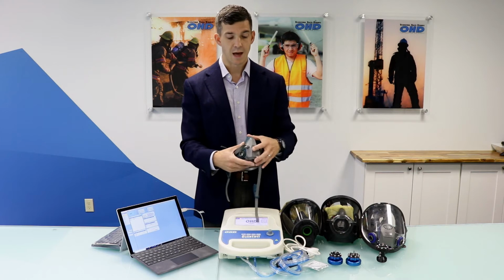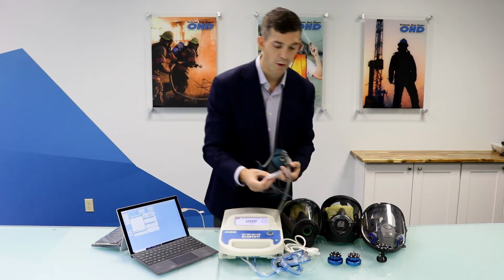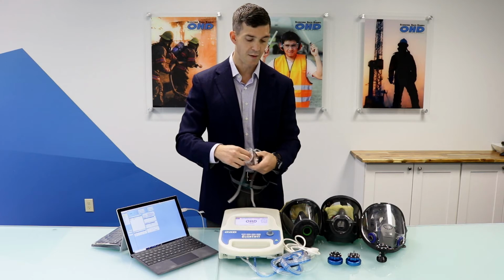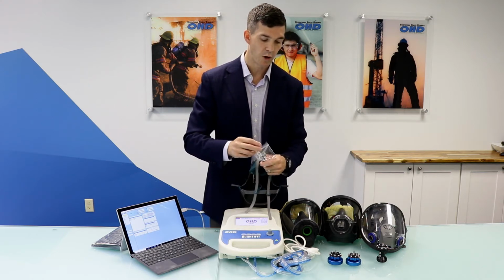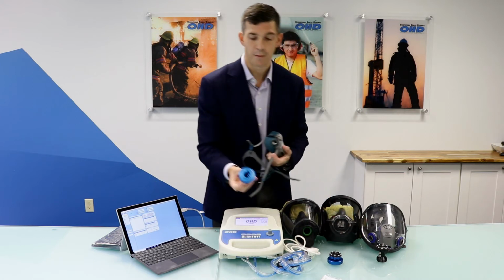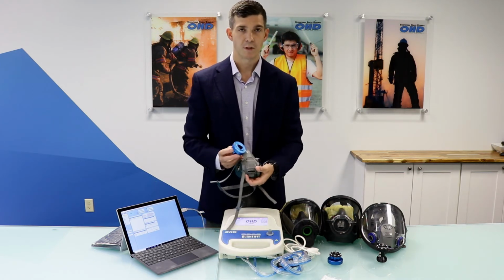So a couple of things. This obviously is a half mask elastomeric. The main thing you need to know about these respirators to test is that they have inhalation valves that must be propped open on the dual side that we connect up to. So let me show you that quickly. Inside of your unit will come a little bag of valve props. So we just prop open this valve and then we connect up our adapters. So the adapters are going to be a dual-sided adapter.